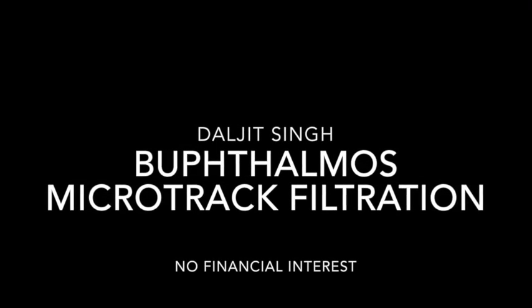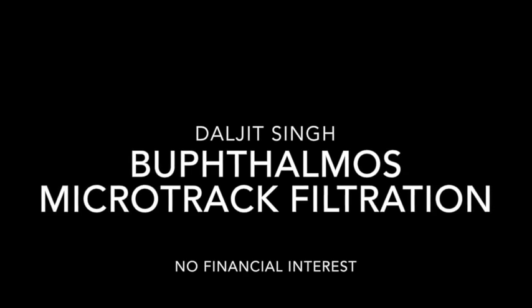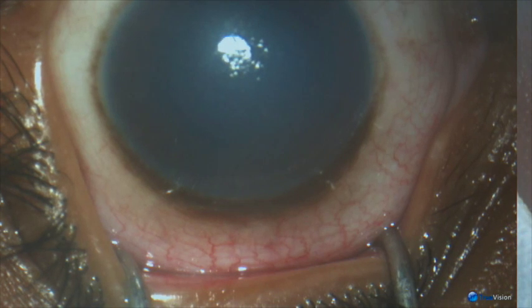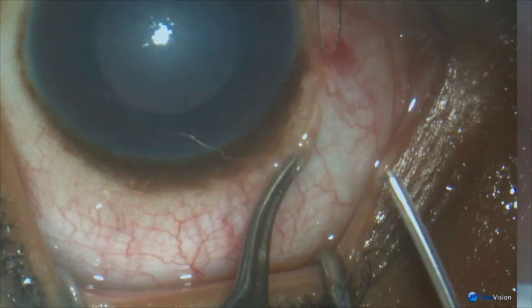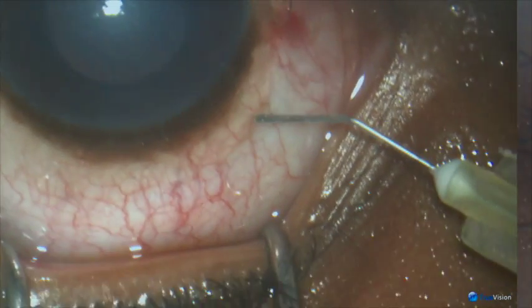Microtrack filtration in a case of buphthalmos. A recent case, a 6-year-old with edema in the cornea.